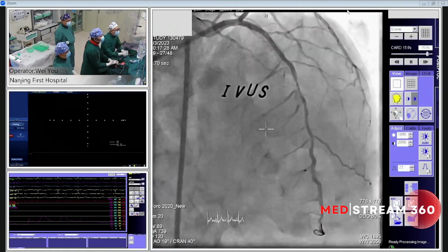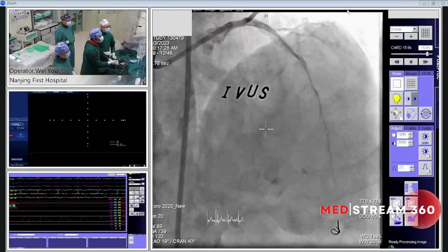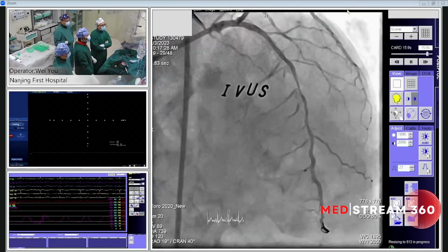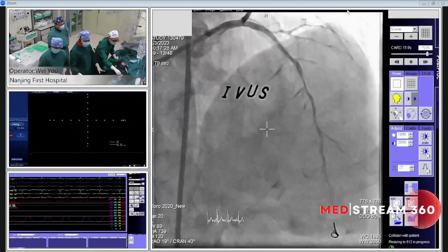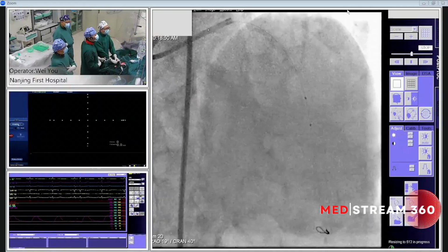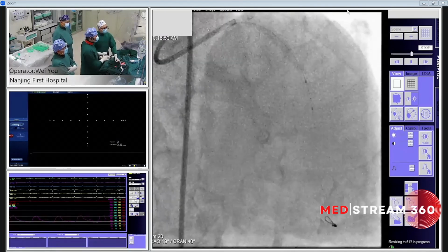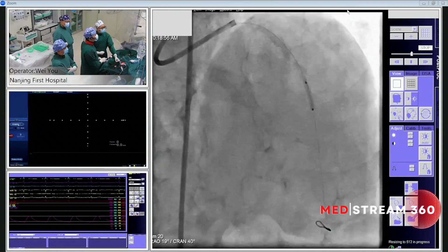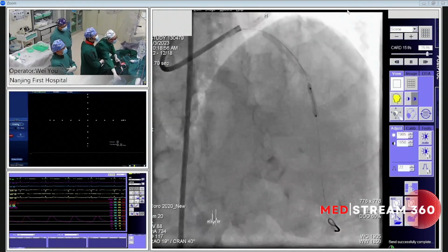So, Chief, I think next for the distal segment, we need the NC balloon to prepare the lesion. Give me a 2.5 NC balloon. So this segment is just balloon dilatable. We just use the nominal pressure. What's the balloon size? 2.5 by 15? By 15, yes.